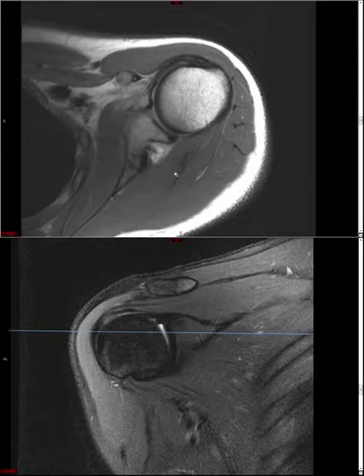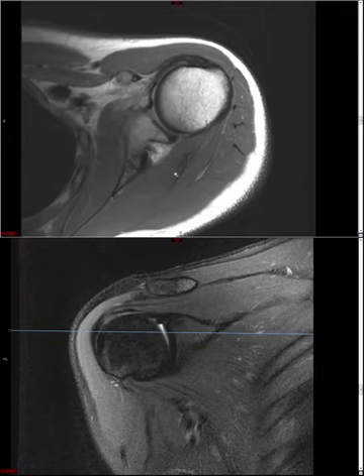You can actually have biceps subluxation without a subscapularis tendon tear, but generally if you see a subluxed biceps, assume there's an underlying subscapularis tendon tear and look for it. If you see one, look for the other. Go back and forth on axials and coronals, asking yourself: is this biceps tendon making it all the way into the groove, or is it cutting a shortcut — a sign of biceps subluxation?